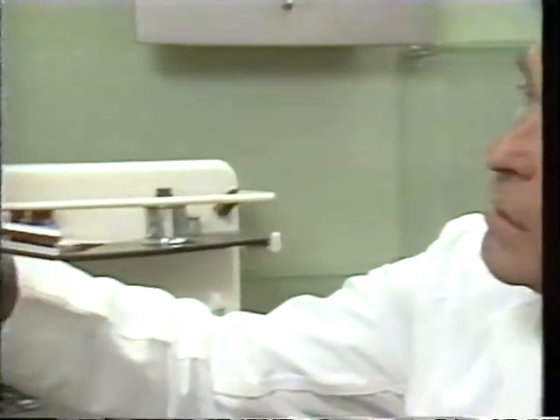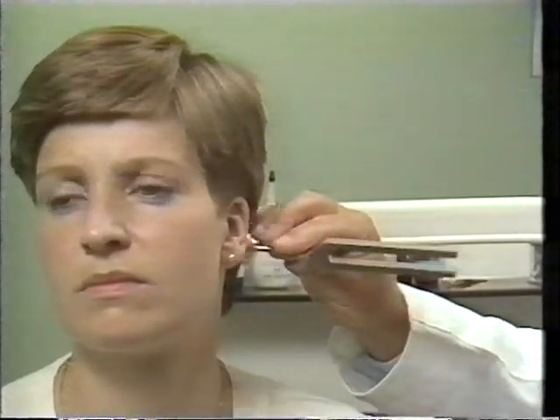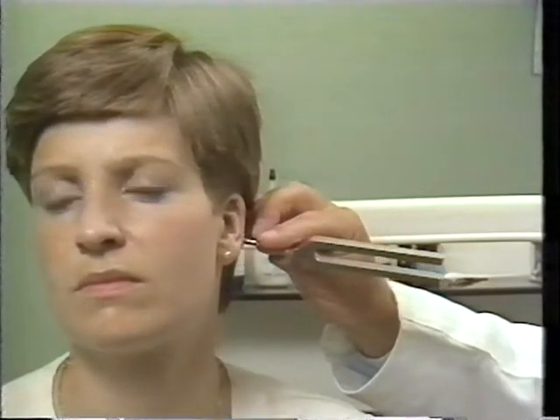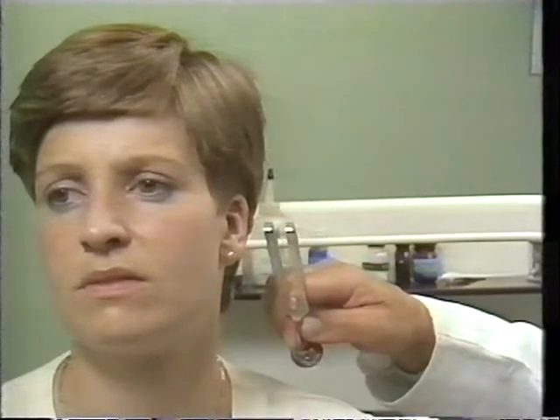A more reliable way of performing the Rinne test and achieving the same aim is to present the stimuli alternately by bone conduction and air conduction until one or other becomes inaudible. Can you still hear that? No. Can you hear it there? Yes. A demonstration, once again, that the patient is hearing better by air conduction than bone conduction, which of course is the normal state of affairs.